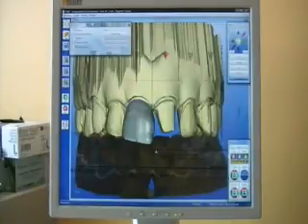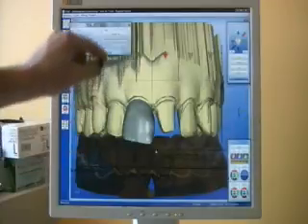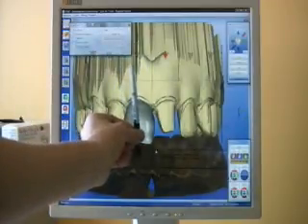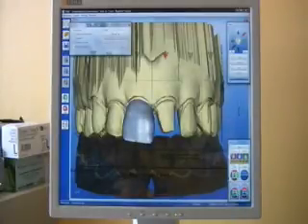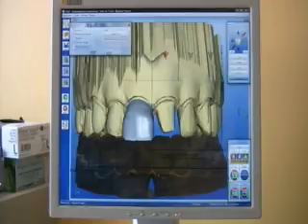There are other clues to help us with consistent resetting of the overlay. Going from one triangle to the other will give us the inclination of the anteriors. The central has that distal inclination, as mentioned before. By using the rotate tool, we can rotate them easily and correct that quite easily.